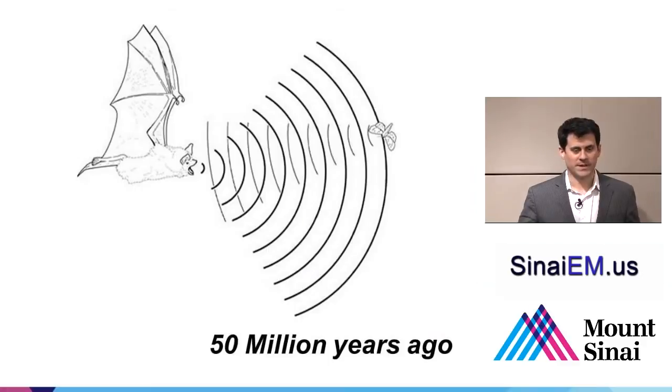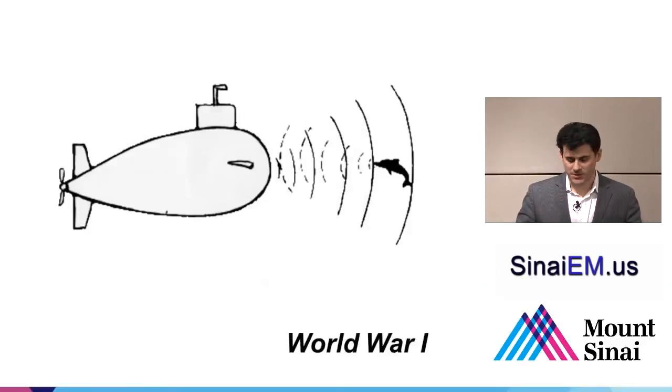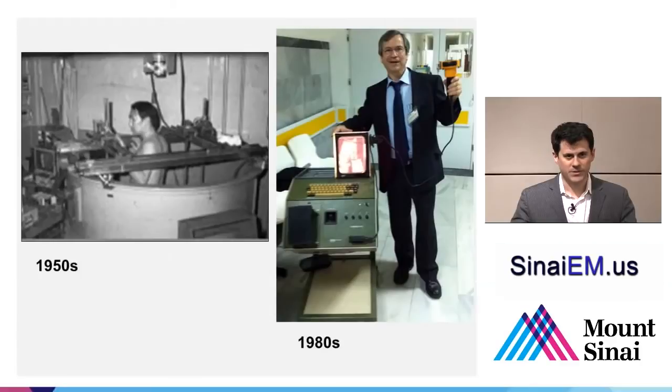So in order to understand how the machine works, we can take it back a bit to some of the first animals to use ultrasound, which were bats. And bats are using high-frequency sound to locate prey, locate the edges of the cave wall, and they've been doing this for about 50 million years. So it was quite a long time before humans caught up. Around World War I, sonar started to be used. So sound waves could be put out into the ocean, and we would hear schools of fish, we would hear enemy ships, and we started to use this technology during wartime, and eventually, there's another 30, 40 years or so before we figured out that it could have medical applications.